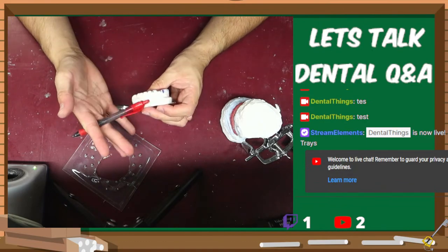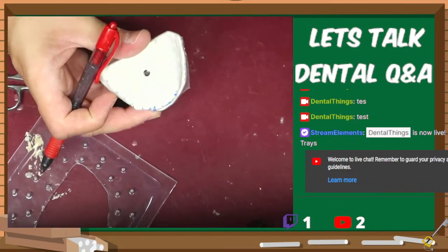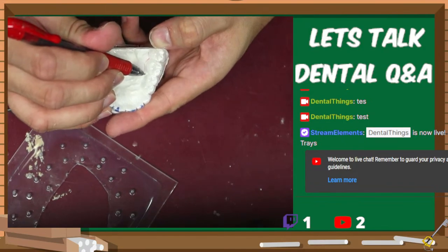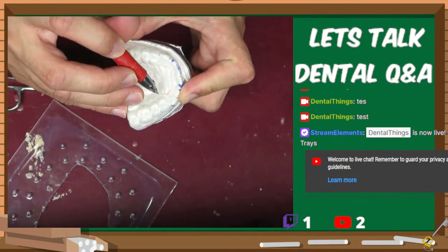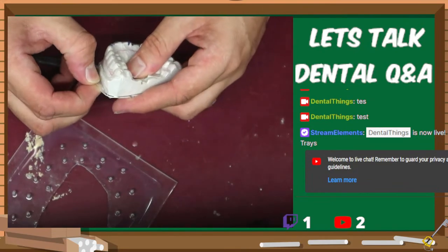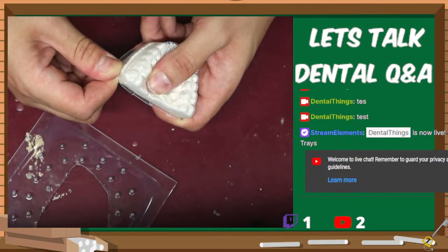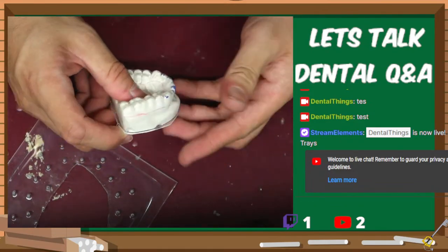And that's usually for the front side. On the back side, we're gonna have to do a little bit of a different cut too, where it's just always going to be straight across. But some people do scalloped or waved at some parts. And so now with this, I can go ahead and forcefully remove this from the model, but you might end up just tearing it or misshaping it prematurely.